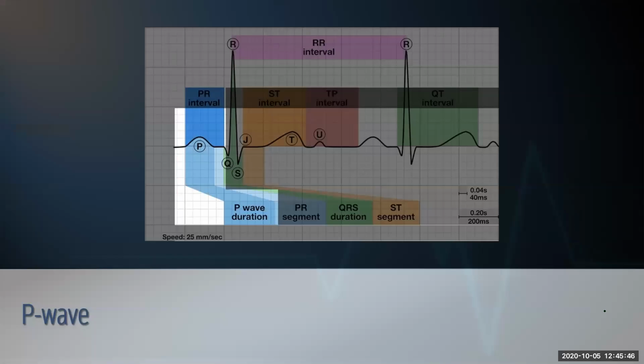All right, so we've gone through rate, rhythm, and axis. What questions do you guys have before I start into the PQRS? No questions. Awesome. Okay. P waves.